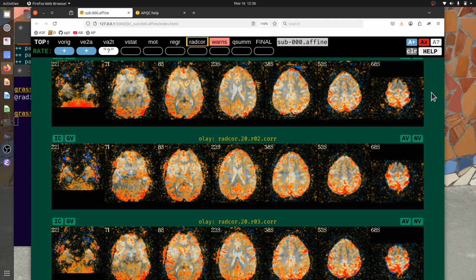And we have not done any regression yet. This is simply by doing the geometric corrections of motion EPI alignment. So resetting where a particular volume of motion is, aligning it to a reference volume, that alone helps reduce some of these spurious high correlations within neighborhoods. And this is pretty typical that we will see correlations.